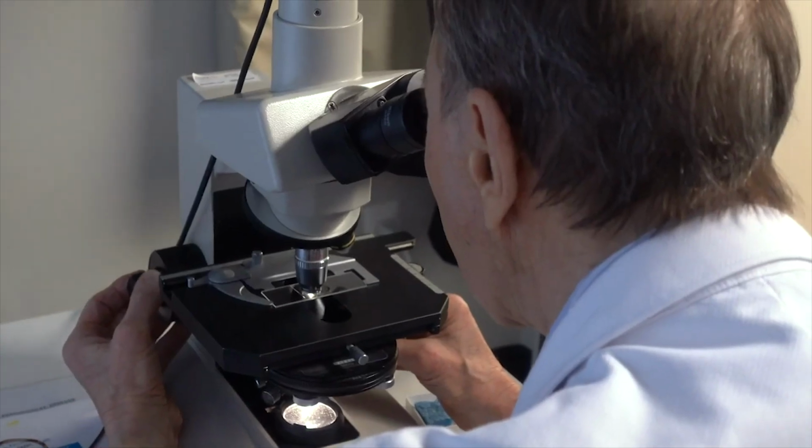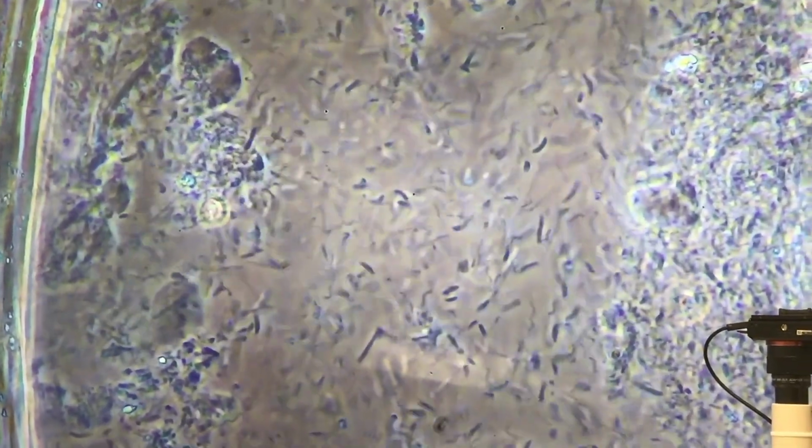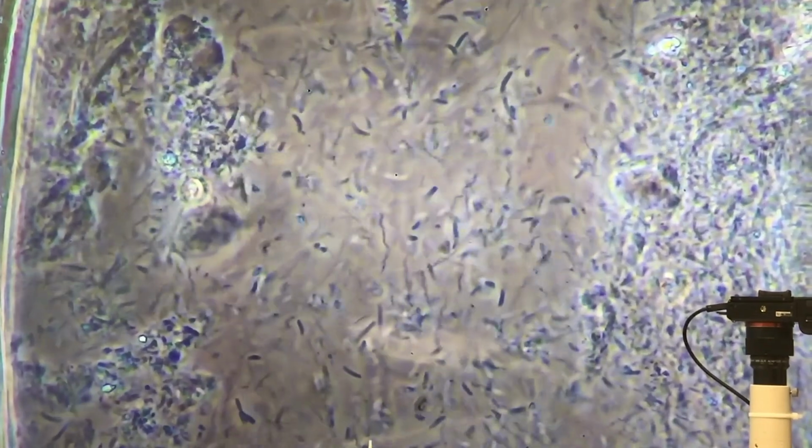Here's the microscope, and that on the left is an amoeba. And we see amoeba, we see spirochetes, we see spinning rods, we see gliding rods, we see trichomonads, all of those things we can see that indicate there's infection. How would you like this going on in your mouth? And this is what we frequently see with patients who have periodontal disease.